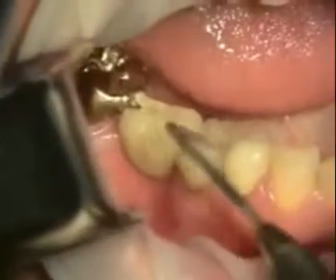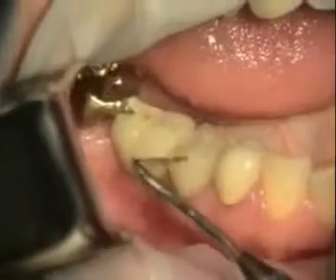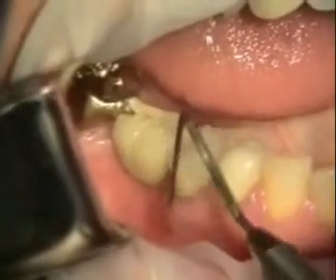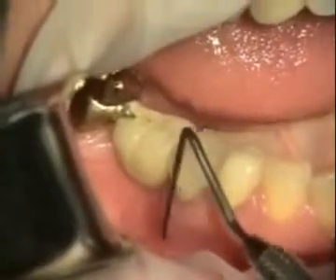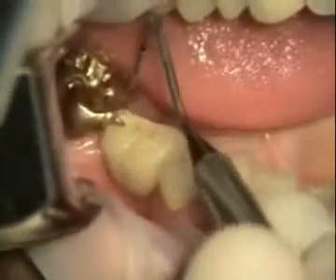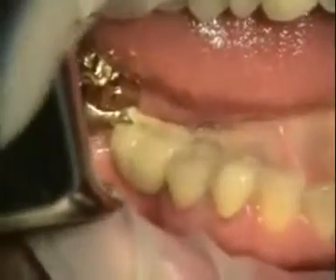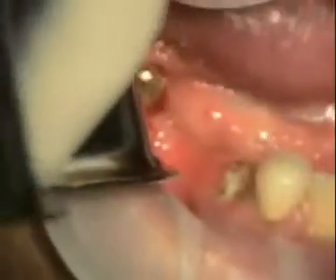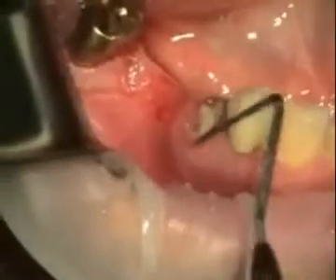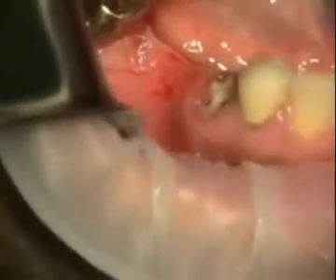Today we're taking tooth number 29 out. It's got a fracture and it's failing — there's a little infection here. What we're going to do initially is just section a bridge. We were looking at that too, but I'm not too worried about that.